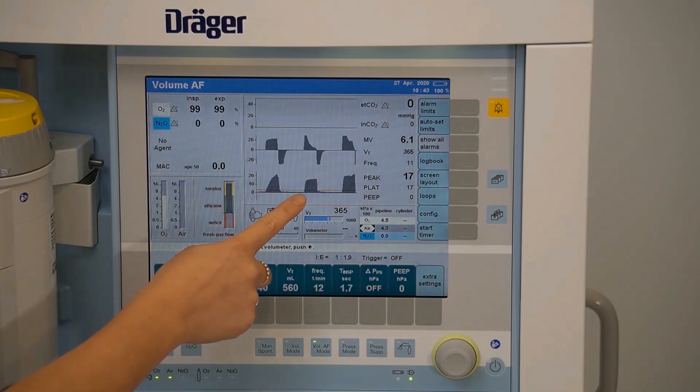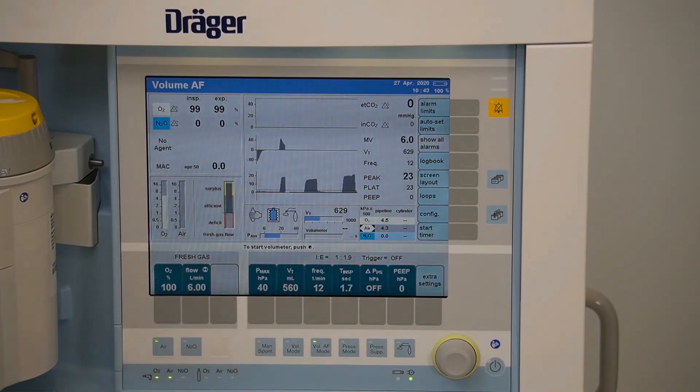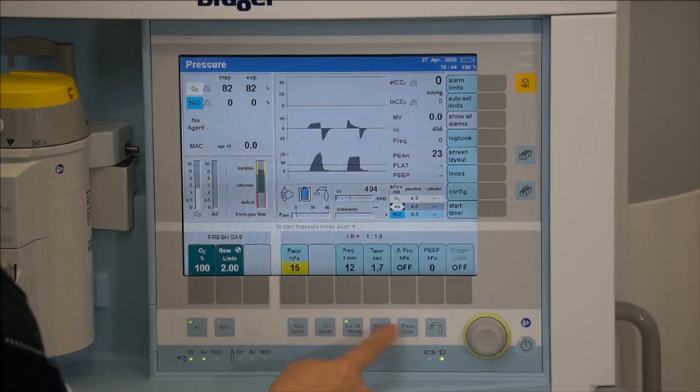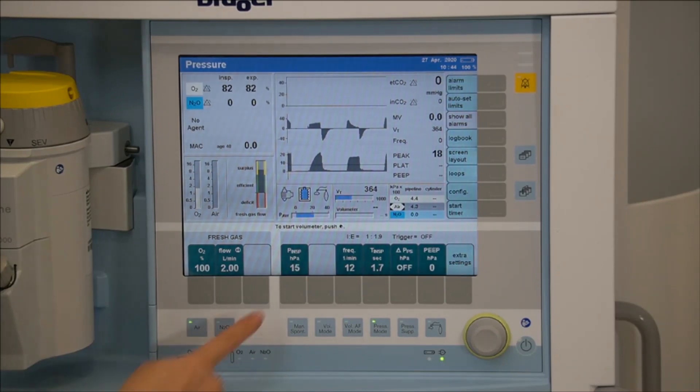Pressure mode allows you to fix an inspiratory pressure level and set frequency of breaths per minute.